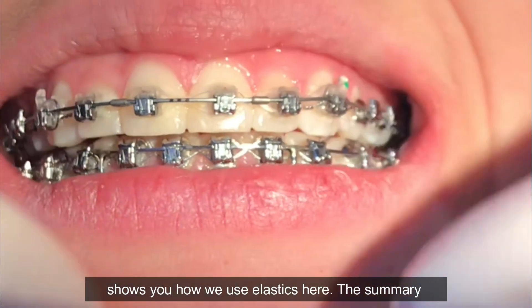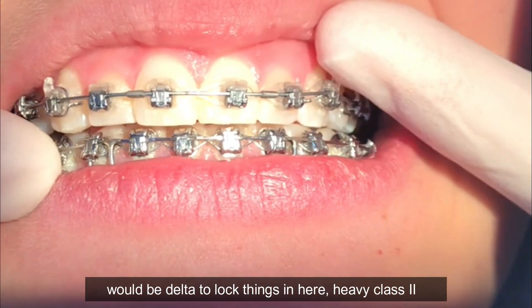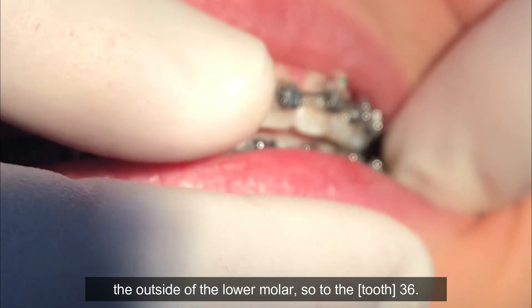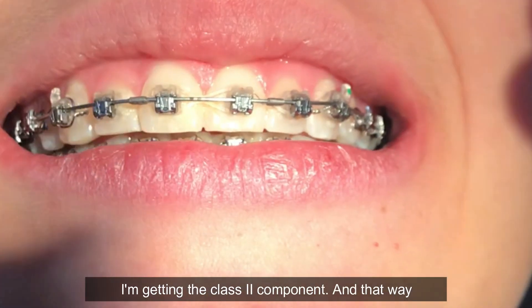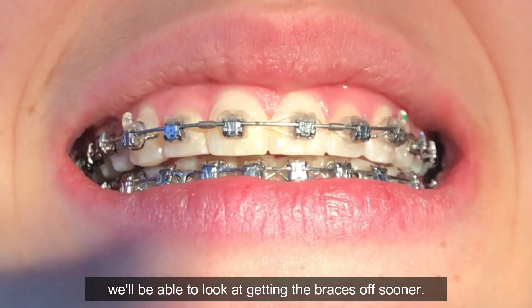On this side, we want to get the canines into Class I but we don't want to cause more cross bite. The summary would be Delta elastics to lock things in on one side, and a heavy Class II on the left but coming from the inside of the upper canine to the outside of the lower molar — the three-six — so I'm getting an expansion component as I'm getting the Class II component, and that way we'd be able to look at getting the braces off sooner.